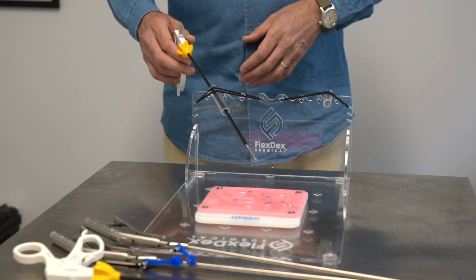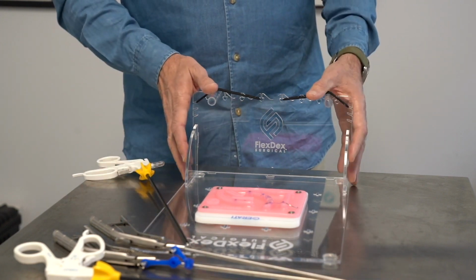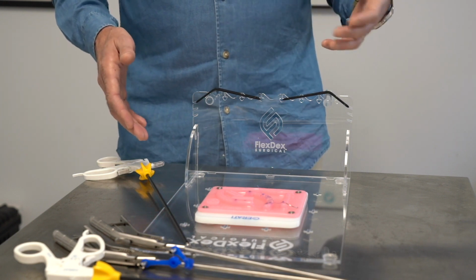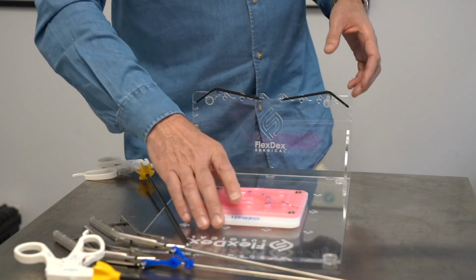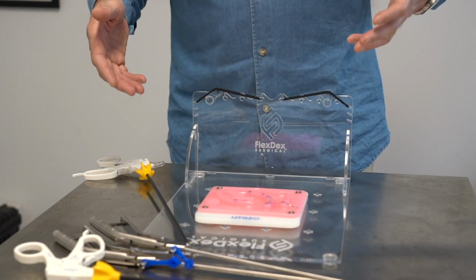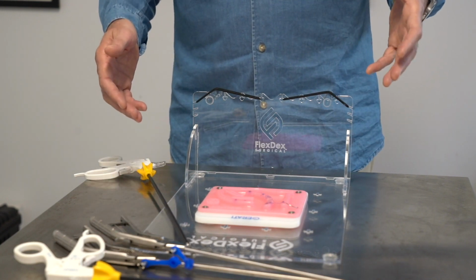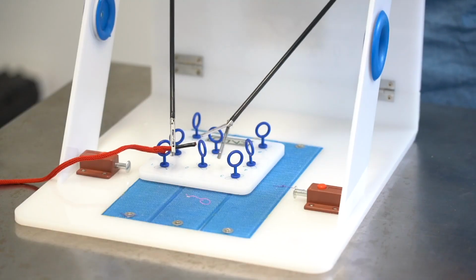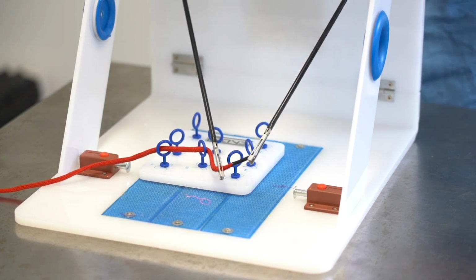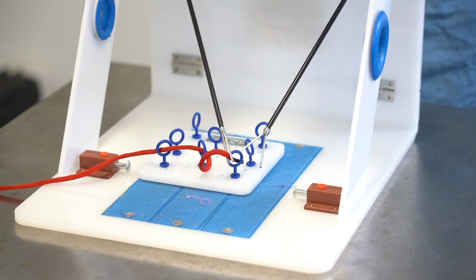skill and precision. Prior to your first clinical case, you should spend a lot of time practicing on a laparoscopic trainer. This one costs about $60, and there are some that cost up to maybe $500. The ones that cost $500 often include multiple different training platforms. Also, they come with a learner's set of surgical instruments, so really it's all you need to get some skill in laparoscopic surgery. So initial training should be just at attempting to get some dexterity, moving with the instruments and recognizing how the movements outside the abdomen are reversed compared to those on the inside of the abdomen.